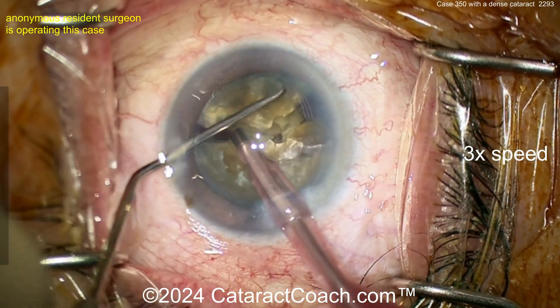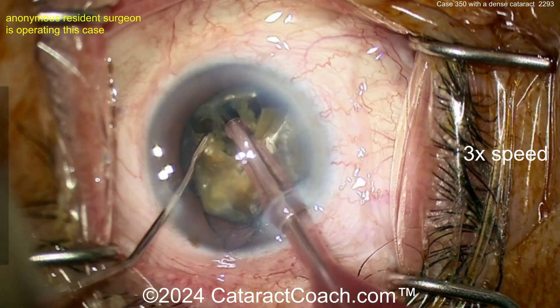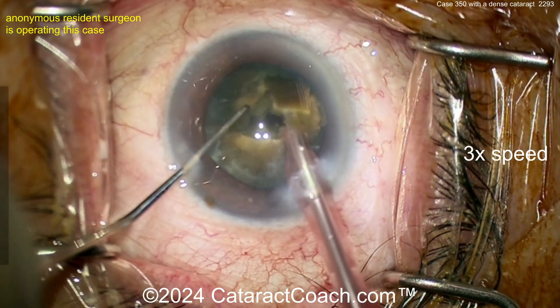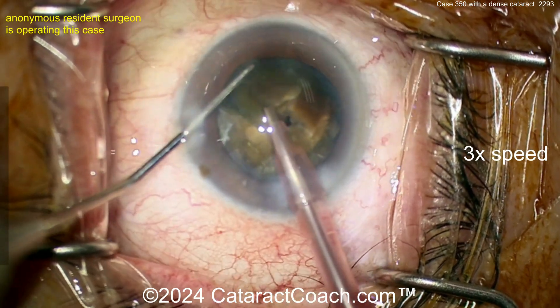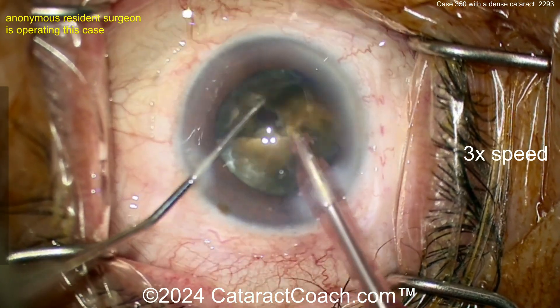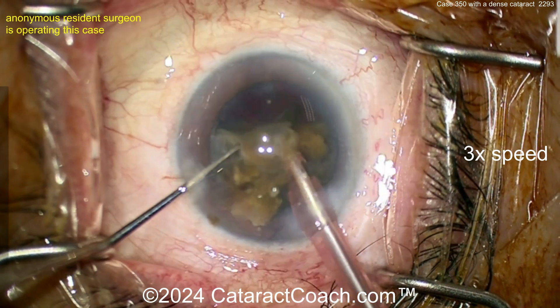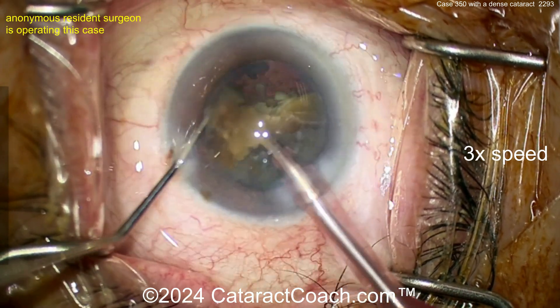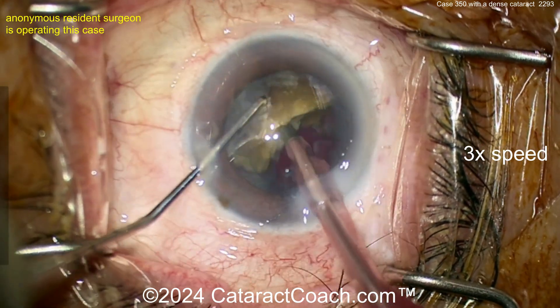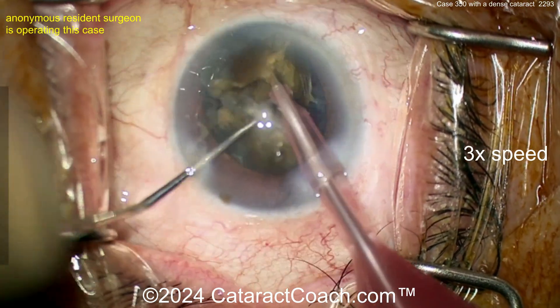Buzzing in here again, doing more chops. See how it's fibrous — the pieces don't want to split apart, that's the dense cataract. The posterior plate especially becomes fibrous. This is why you've got to take your time, using phaco power modulations. Look at the good job floating within the incision with the phaco probe — you don't want to push up against the side of the incision. You're using more and more energy here, so know your phaco power modulations: burst mode, pulse mode. If you're using pulse mode, get that duty cycle to at most 50%.